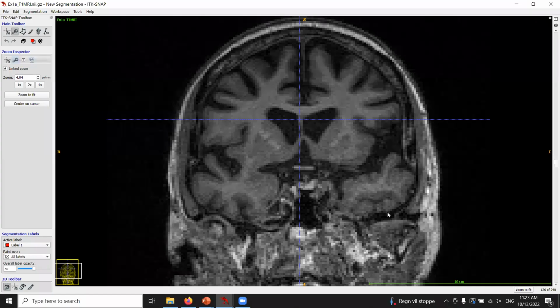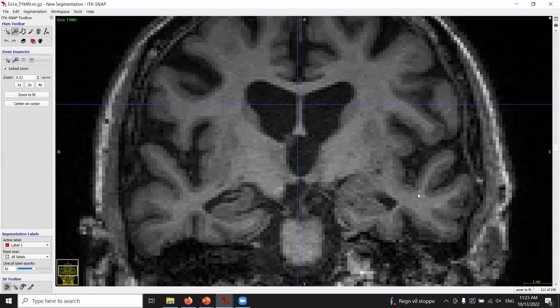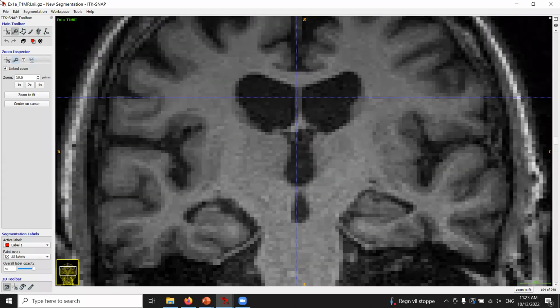So here is the first example. If I scroll through, and for example look in the left hemisphere on the right side of the screen, I just want to show that I can see the border here. I'm just outlining what I'm interested in. Obviously, when I would do QC, I wouldn't do it, but I'm showing you with these outlines what I'm looking for.